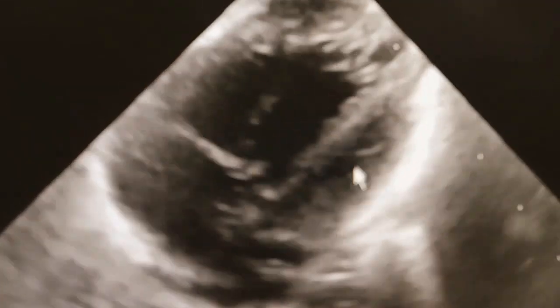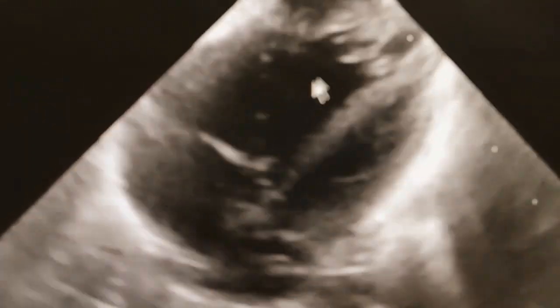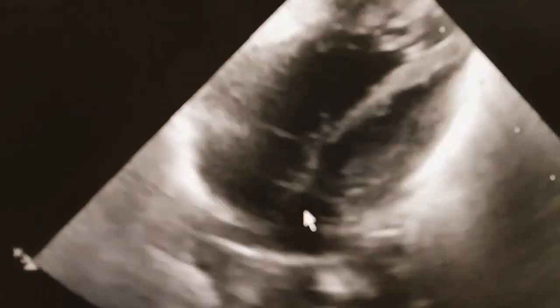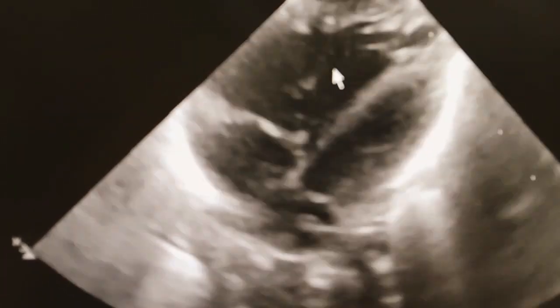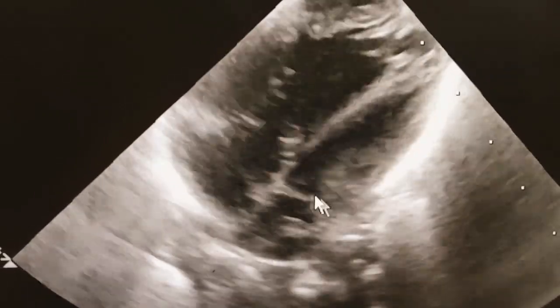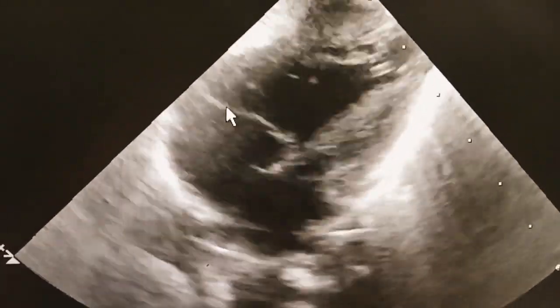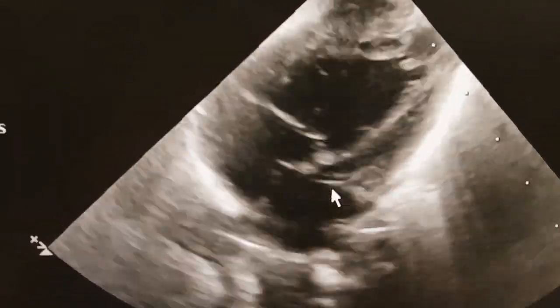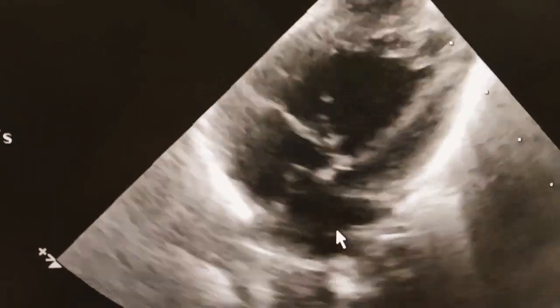Here you can see the left ventricle, the interventricular septum, and the right ventricle — the right ventricle is big. The left ventricle is small, and the left atrium is small. But the right atrium is big. This is very classically seen in hypoplastic left heart syndrome. Also, the annulus of the mitral valve is not well developed — that is another feature to look for. So in summary: right atrium big, right ventricle big, left ventricle small, left atrium small. Sometimes in restricted ASD, the left atrium can also appear enlarged.